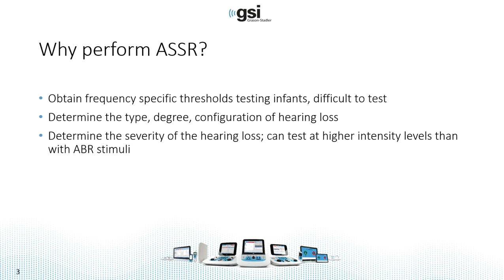We perform ASSR to obtain frequency-specific thresholds in infants and difficult-to-test patients. We determine the type, degree, and configuration of hearing loss and can often determine the severity of the hearing loss by testing at higher intensity levels than we can with traditional ABR test stimuli.